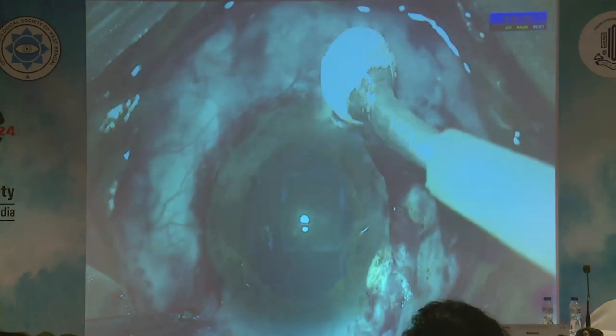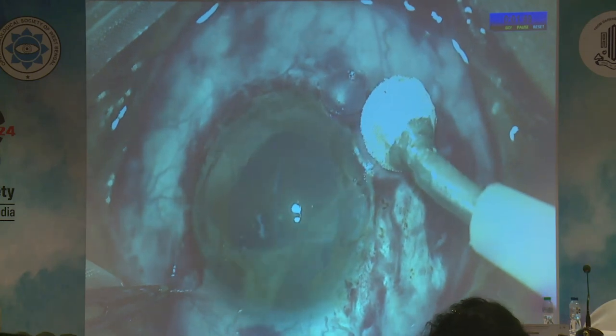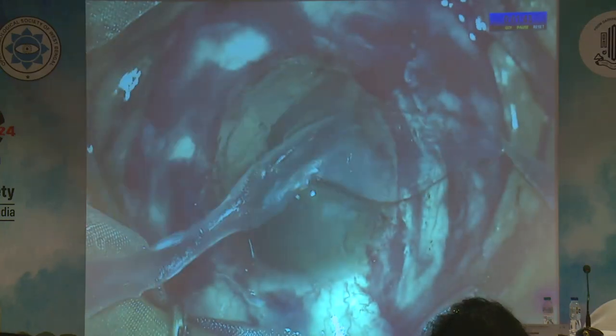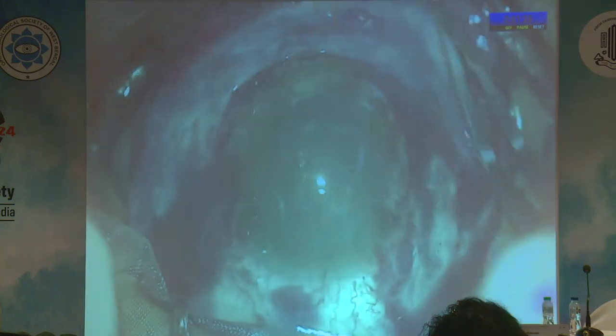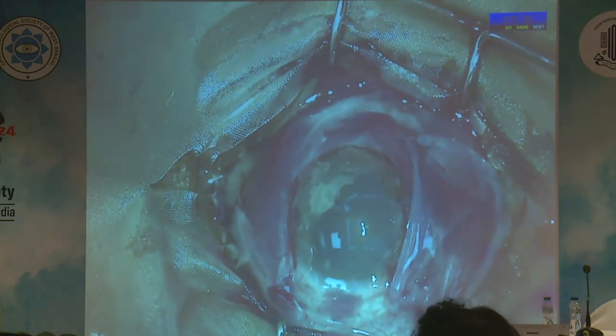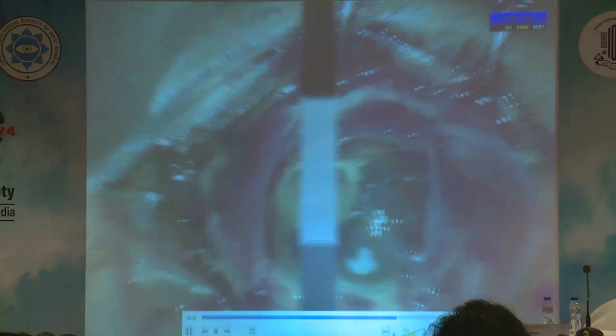A double freeze-thaw cryotherapy was applied in the inferior limbus because of deep invasion and to prevent recurrence. An amniotic membrane was laid down with fibrin glue to close the defect. A bandage contact lens was applied and the surgery is completed.